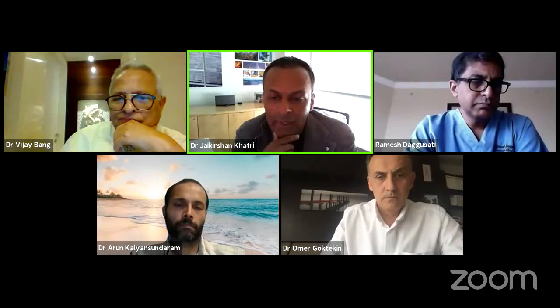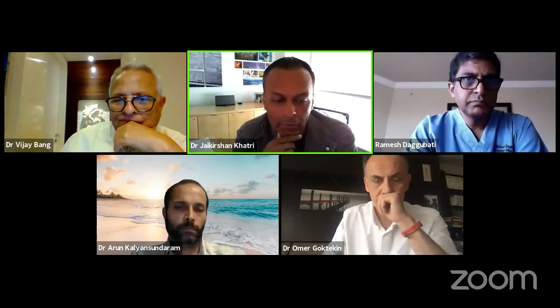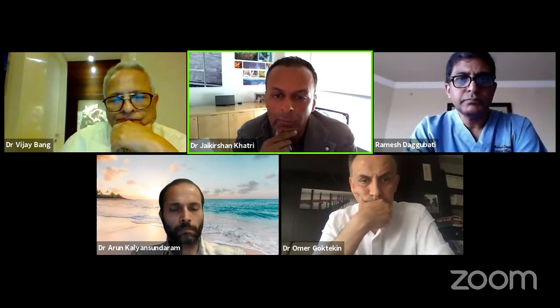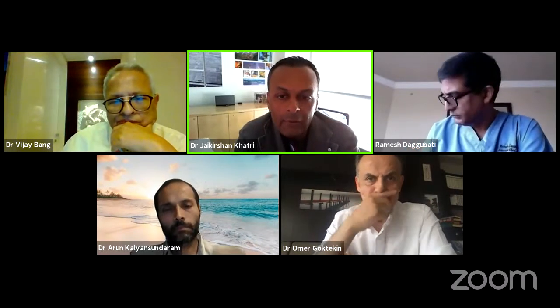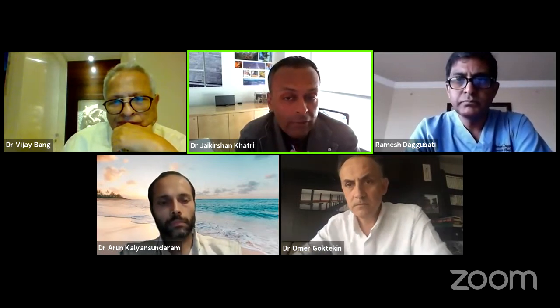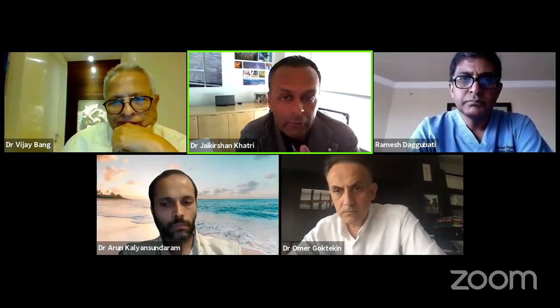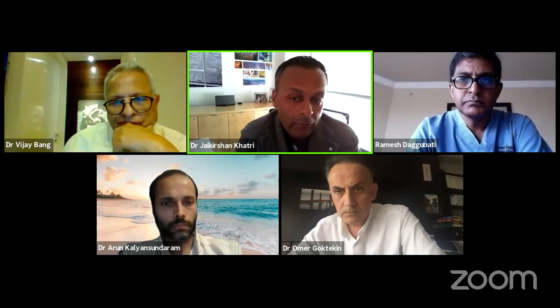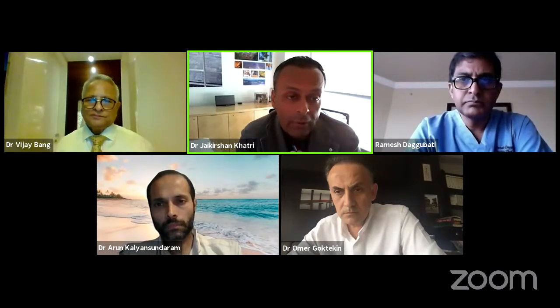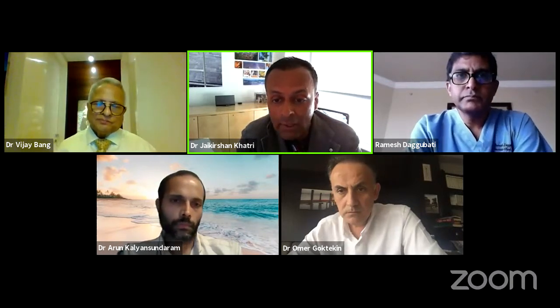Well, I think the main thing is to be aware of all of those things. So first of all, we use a specialized fluoro package in our room, very low magnification, 25 centimeters, low frame rate, 7.5 frames per second, very little acquisition. Almost everything is done under fluoro saves to minimize radiation dose. We try to use minimum contrast. We use ultrasound guidance for most of our stenting and optimization.